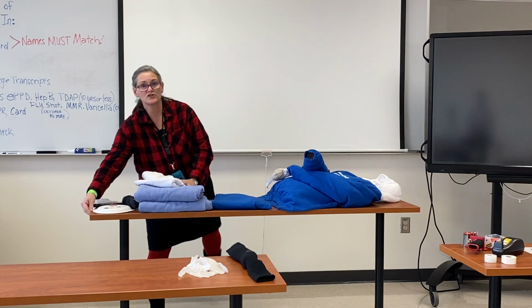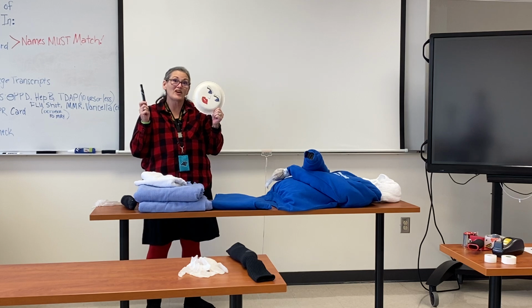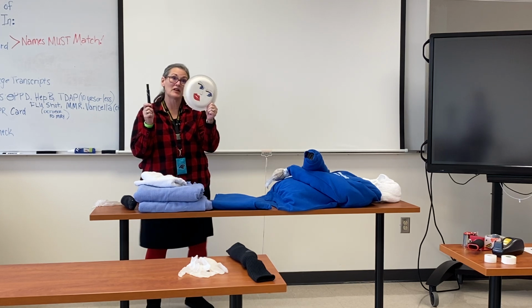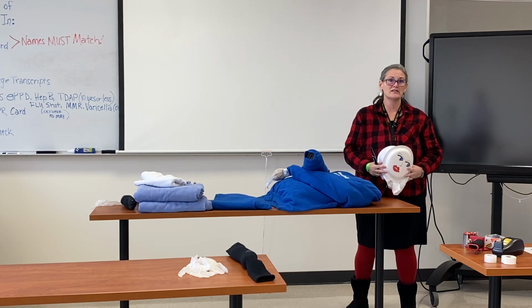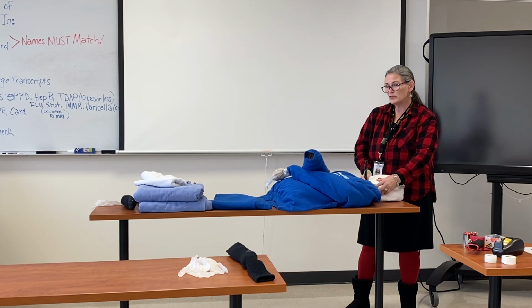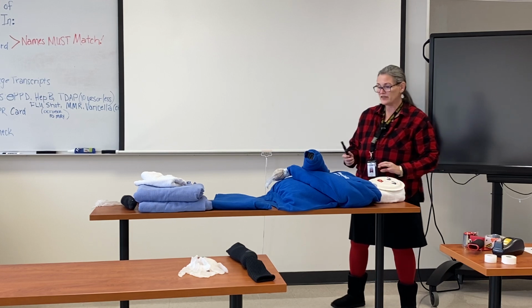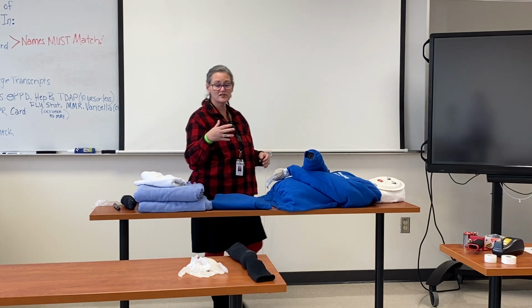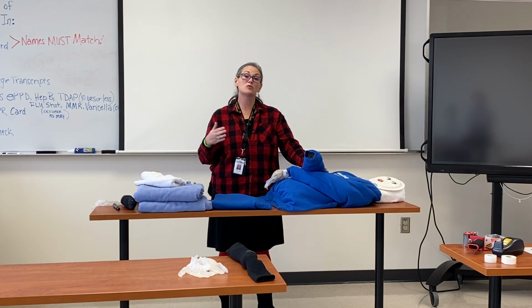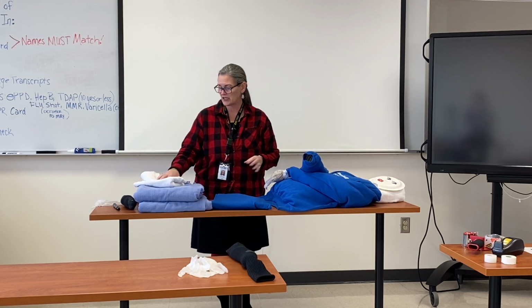And if you really didn't like that, you could do like I did. A marker, a permanent marker, and a paper plate. You could take that to the towel, and now Granny has a face. Granny will need some ears, so you could draw ears on here. One of the skills that you're going to learn in this program is doing some passive range of motion, and that's one of the landmarks that you'll need to use when you're practicing that particular skill.